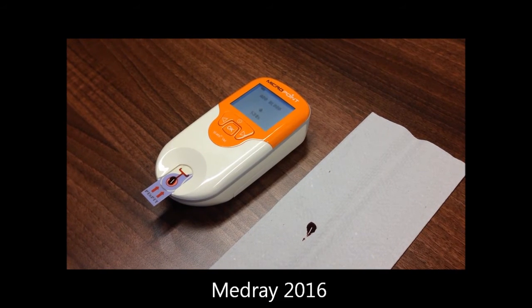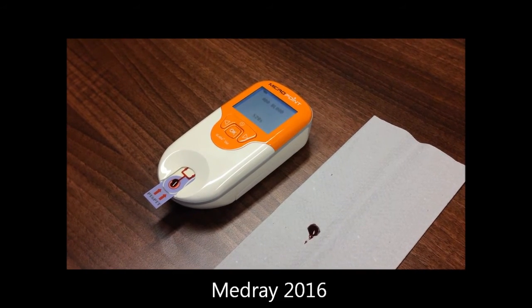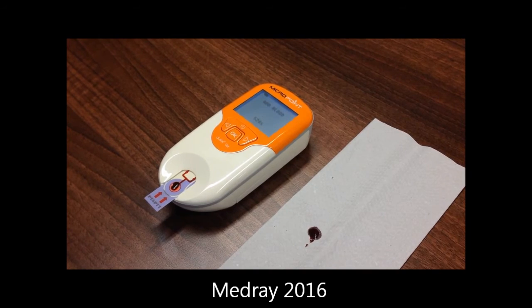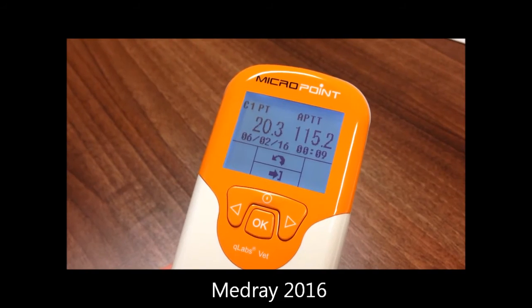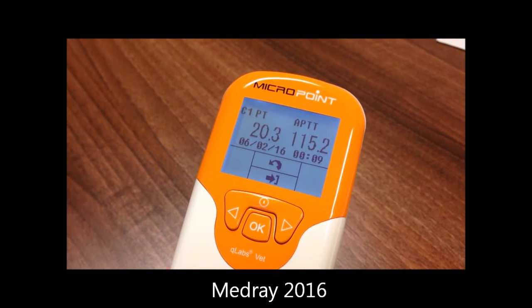Do not exceed 20 seconds from venepuncture to adding the blood sample, and ensure that the blood completely fills the sample well. Do not move the unit or strip during testing. When testing is complete, results will be displayed.